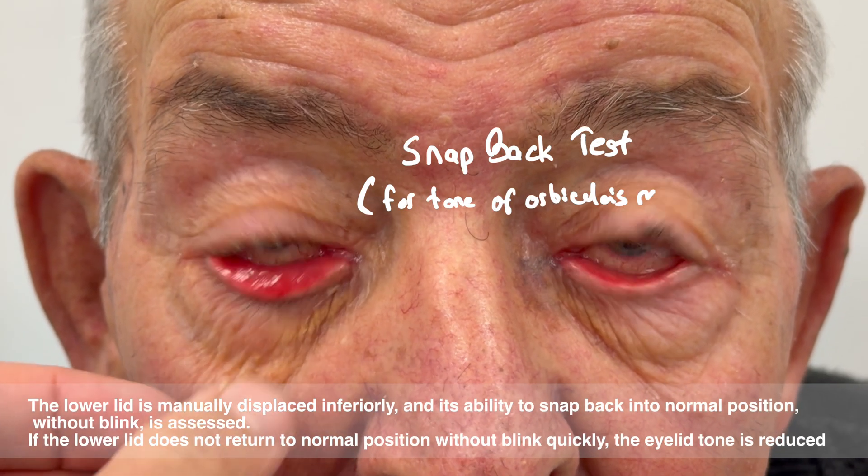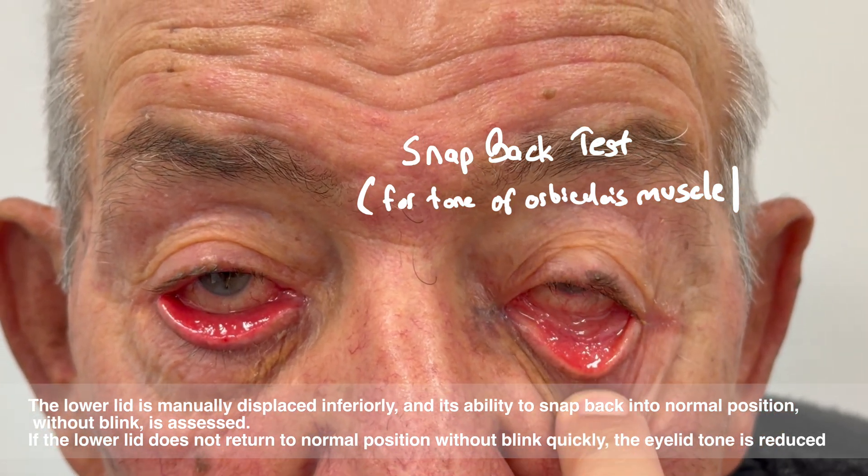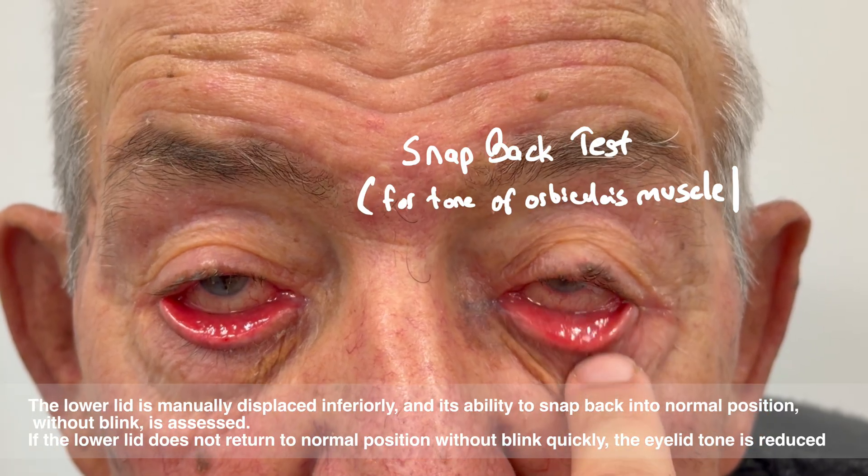At the beginning, it's essential to check for lower eyelid laxity. Let me show you a few of the tests we use to evaluate it.